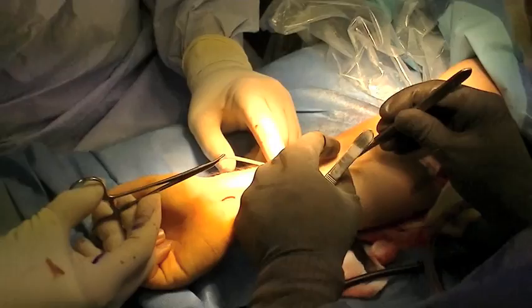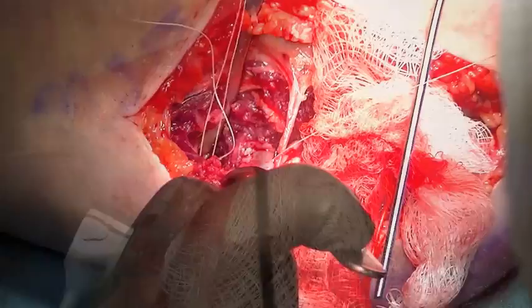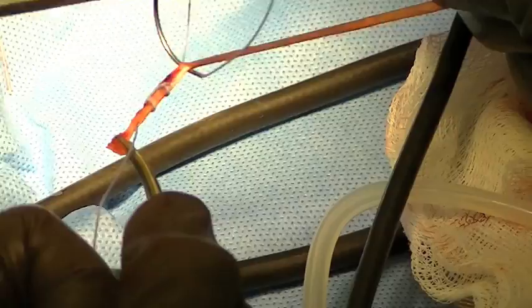The palmaris longus autograft is harvested using a series of small incisions. The entire palmaris longus tendon is harvested all the way up to the limits of the musculotendinous origin. A 3 mm cutting burr is used to make the holes on either side of the sublime tubercle. These are then connected with small curettes, and sutures are passed in order to pass the tendon graft, which is then doubled and reinforced with a suture measured to the appropriate size.